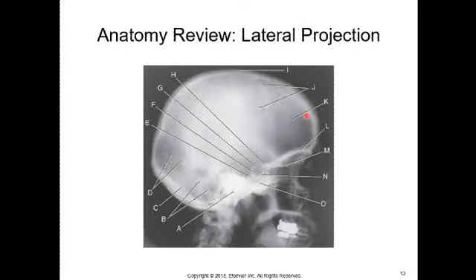If you were to get a radiograph like this, you would have to label all the areas of interest. The ones that are a little bit more difficult to see, I would probably provide for you just because it wouldn't be fair. So like, remember I said the EAM is really hard to see. This letter A here, that's actually pointing to the EAM, and you can't really see the hole. So something like that I would give to you, but the rest of it you would be responsible for. This section here is very difficult to see, letter J. That's a suture line. So even on the computer screen, it's difficult to see, and on your printed tests, it would be even more difficult to see.